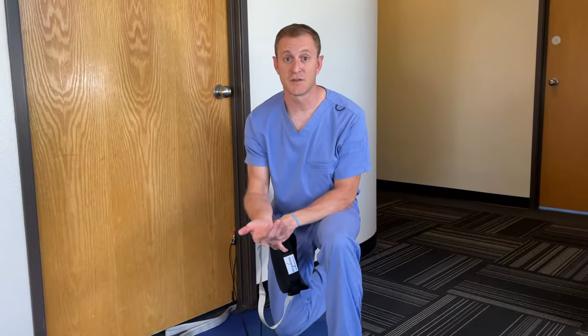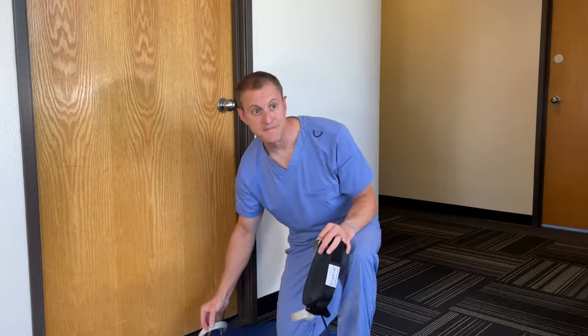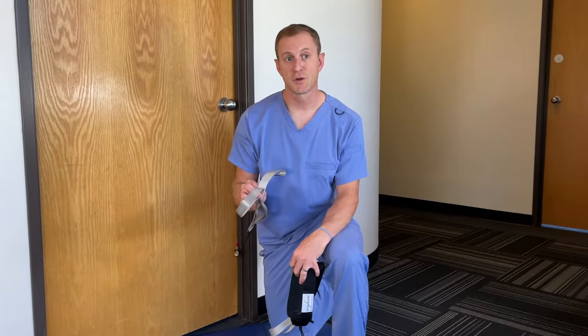It is ideal to lay on a yoga mat or some other grippy surface so that your body is less likely to be shifted towards the door as you pull traction force. I also recommend wearing athletic shoes with a rubber sole for better grip and control when your feet are in the foot loops and you're applying pressure with your feet.